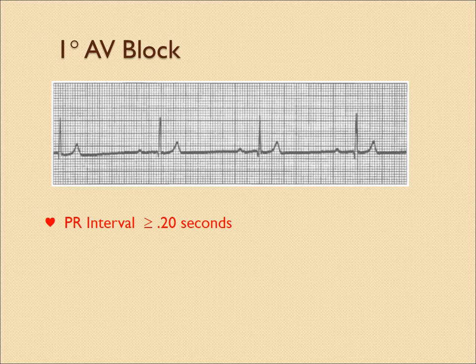I would like you to just focus on the fact that everything is moving along the way it should. The problem is that the PR is too long. We see this very commonly with our patients. They'll have a 0.24, 0.28. They won't have any other symptoms than that.